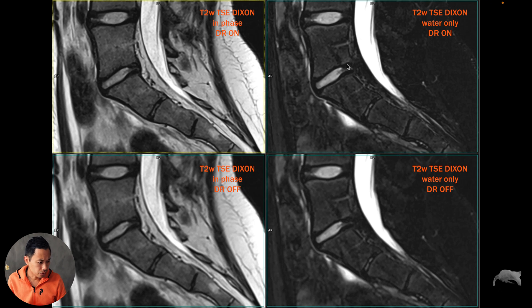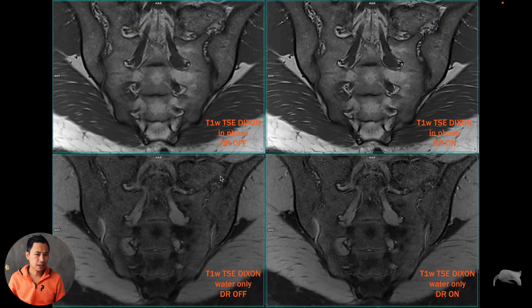You can see here the water-only seems a little blurry with Deep Resolve off. This is another case — on the left side, Deep Resolve is off. This is the T1 Turbo Spin Echo Dixon: in-phase, water-only, in-phase, water-only. Take a look at the structures — Deep Resolve off versus Deep Resolve on, it's much much sharper. This is exactly what I want for good in-phase images. The water-only also looks sharp with Deep Resolve on.